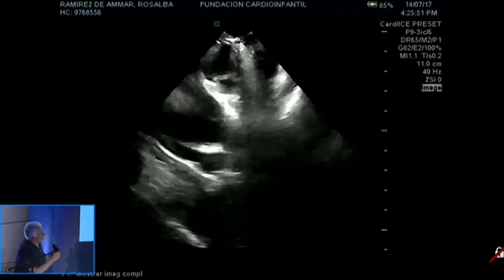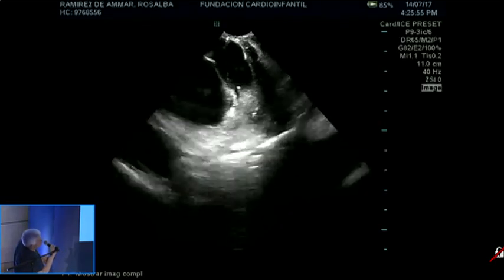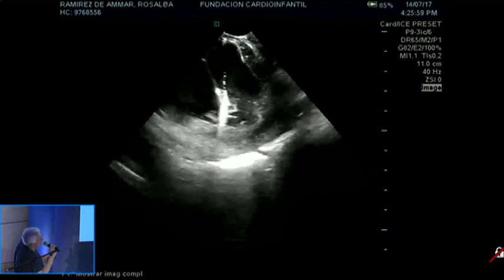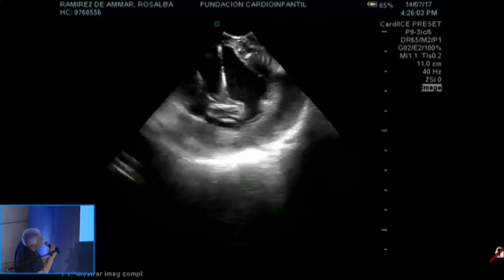You can see how it's hypertrophied with very strong contractions. Fluoroscopy now. Go ahead, Andrea. Did you use a sheath to support you? Yes, I am going to show that. Yes, the sheath was used.